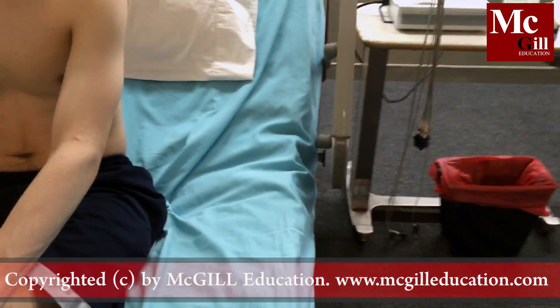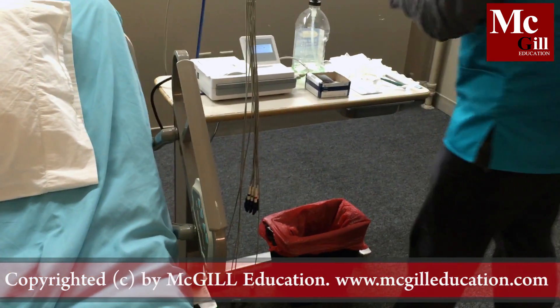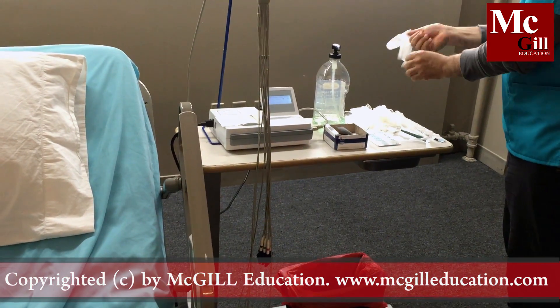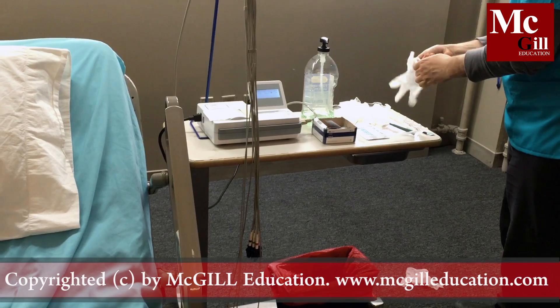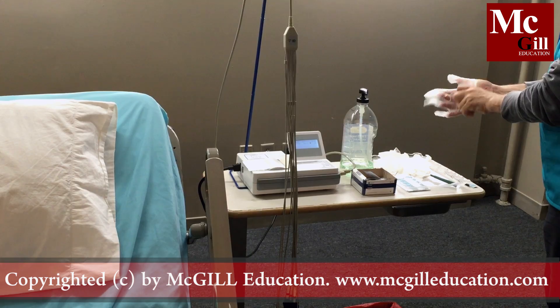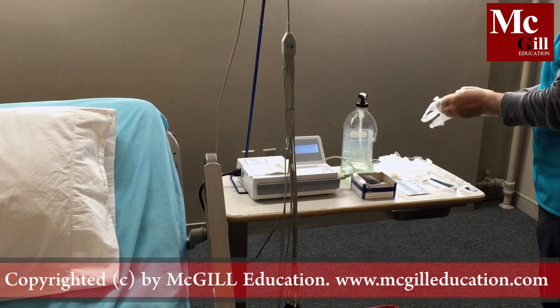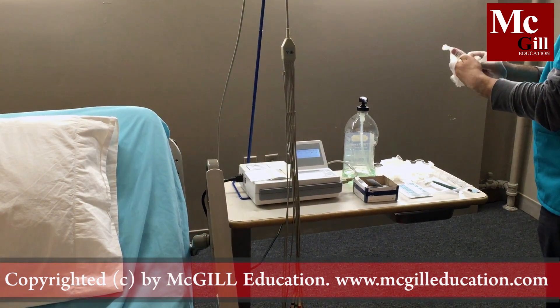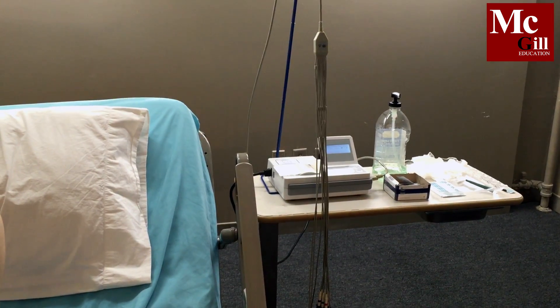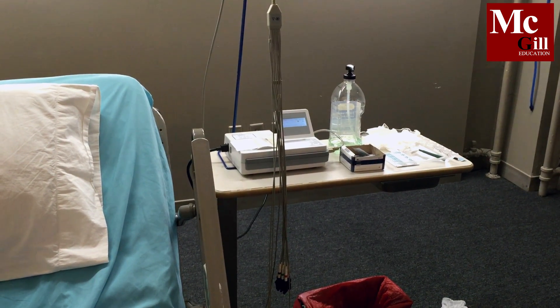Ensure that you wash hands and don your gloves. Greet the patient and identify yourself. May I ask you a question? My name is Jane Johnson.